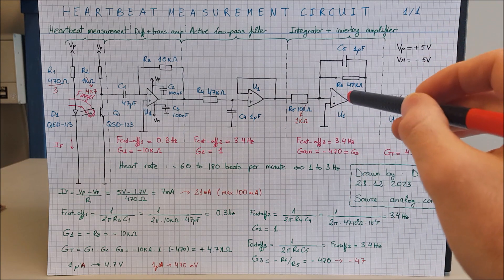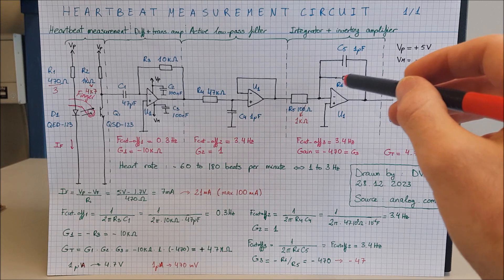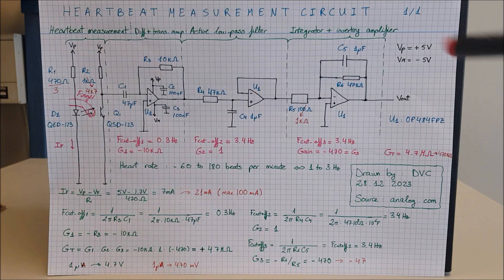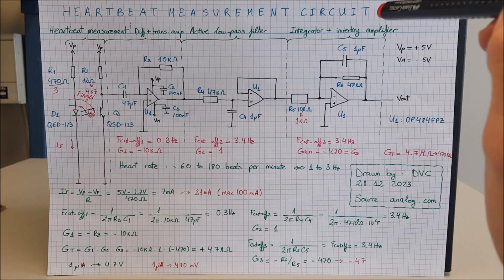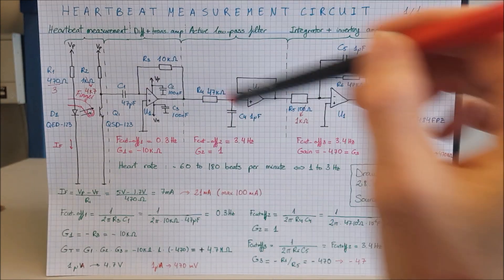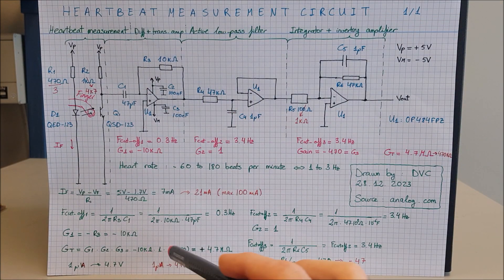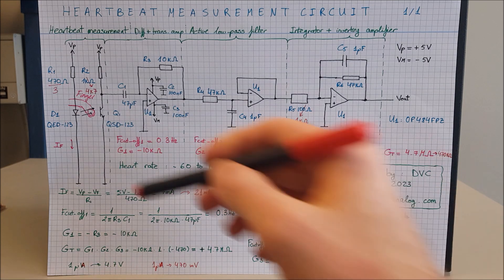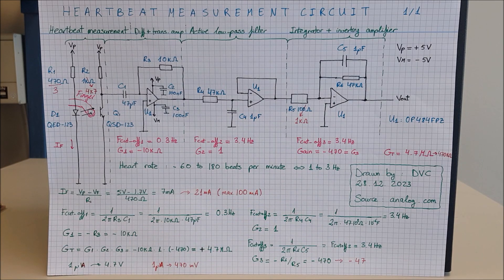We have an inverting amplifier with a gain of minus R6 divided by R5. That is minus 470. Let's put everything together. At the output, we will have a voltage signal whose gain is the gain of the third stage times the second stage times the first stage. That is minus 10 kilo ohms times 1 times minus 470, which is 4.7 mega ohms. It means that a current of 1 microampere produces 4.7 volts.